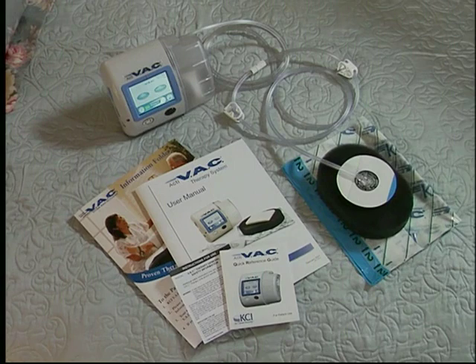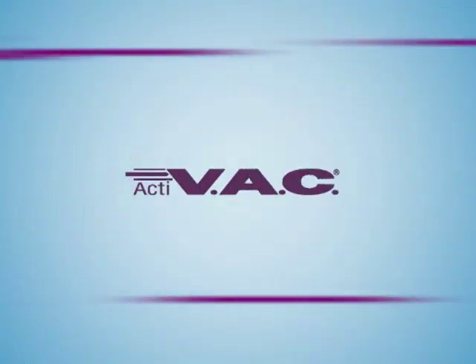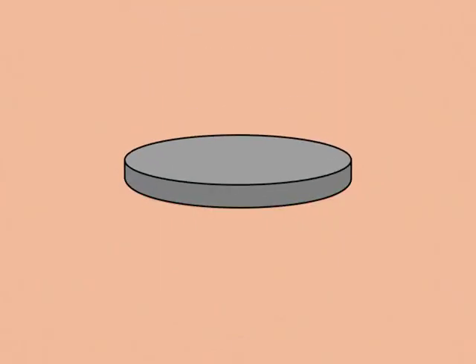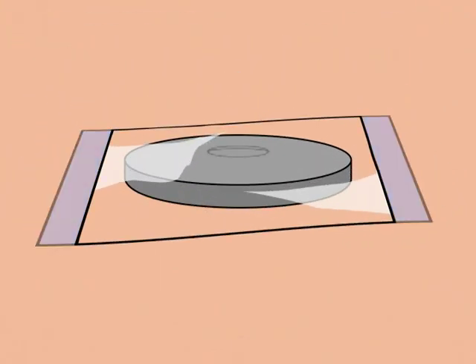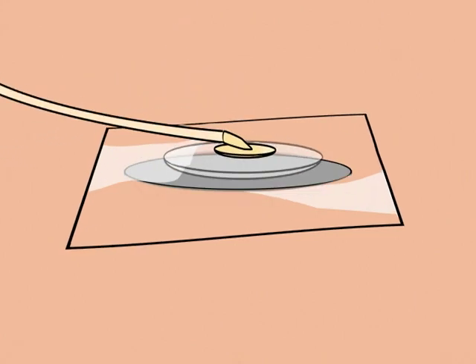The ACTIVAC Therapy unit can operate through an internal, rechargeable battery, which lasts up to 14 hours. The ACTIVAC Therapy system is a complete wound healing system with a lightweight therapy unit, special foam dressing, clear adhesive drape, Sensatrac pad with tubing, and a disposable wound fluid collection canister.